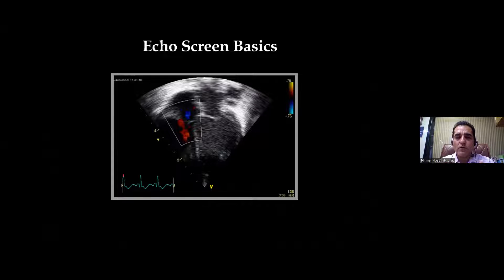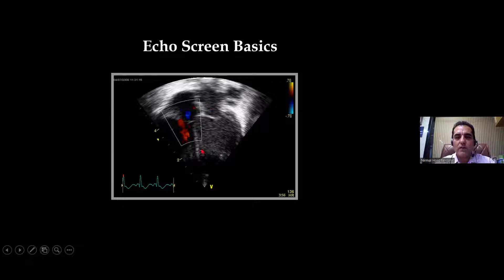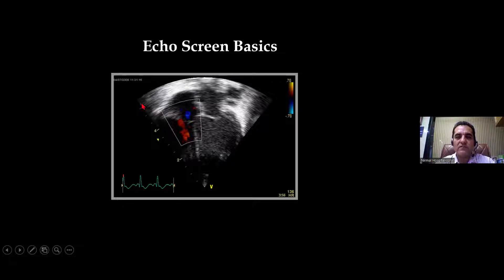When we go for these pathologies and start an echo, the first and foremost thing we tend to see is the echo machine screen — this is how our echo machine screen looks like. We do echoes, the ultrasound of the heart, with the probe. The probe we use is a phased array probe or sectoral probe.